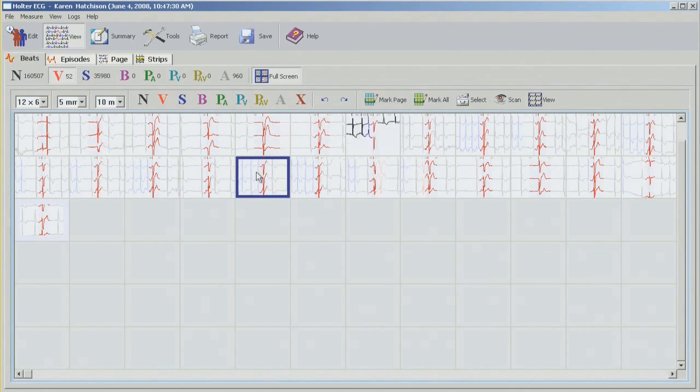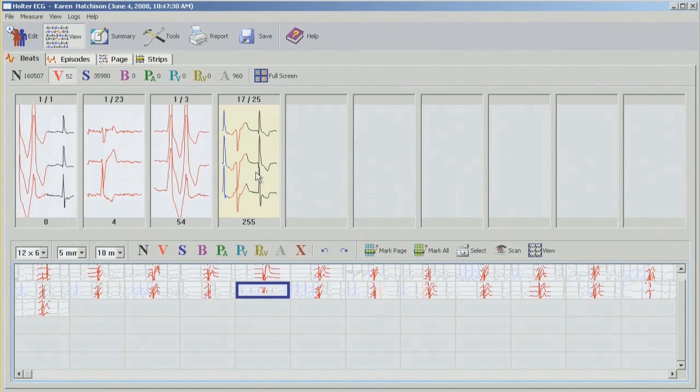And what we're left with are just ventricular beats. So again, going back to the bins. And we've pretty much finished editing all the ventricular beats.